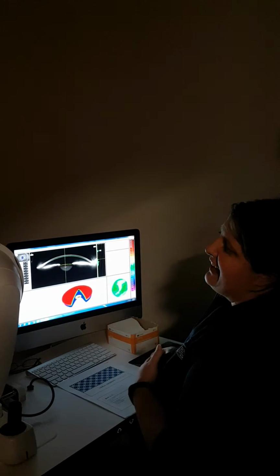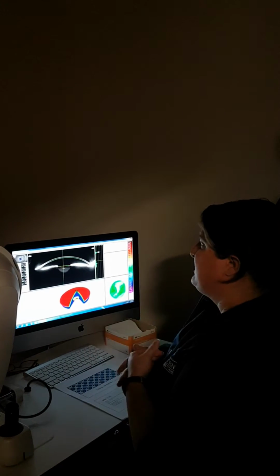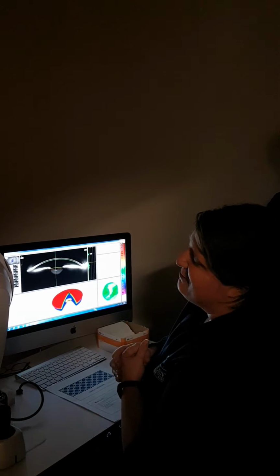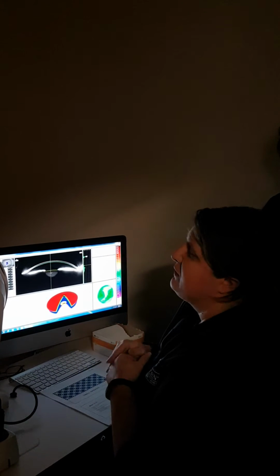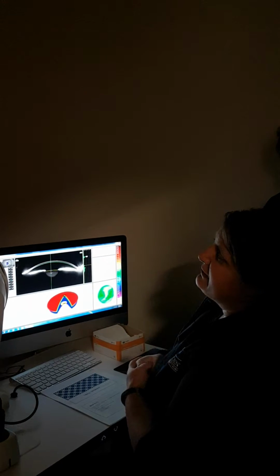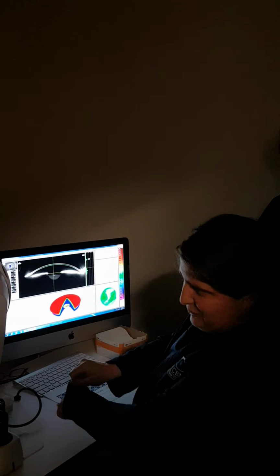So if you're unable to get Ks, try the handheld. Again, those patients we're probably not going to do any kind of upgrade for, and it's probably an irregular or upset cornea anyway, okay? But for our normal screeners, you should be able to get an okay result, okay?